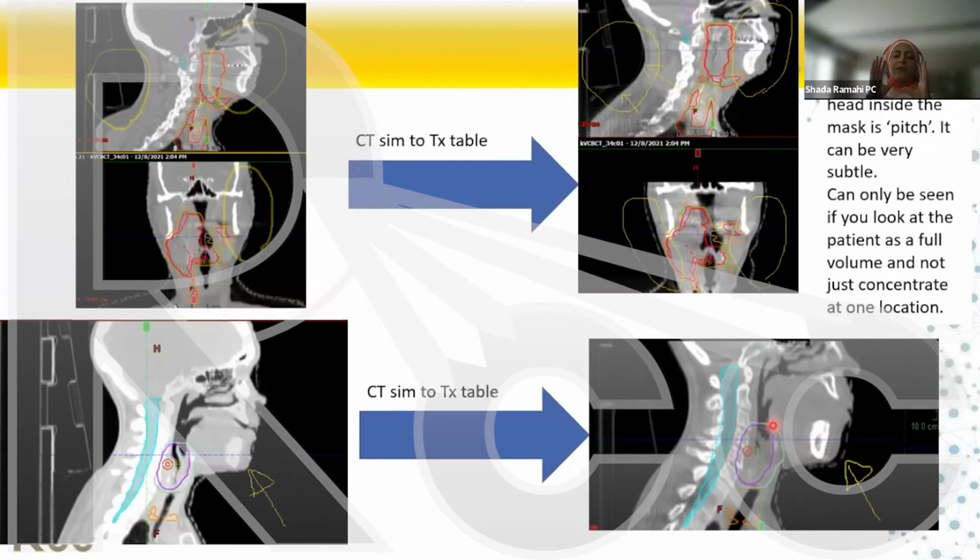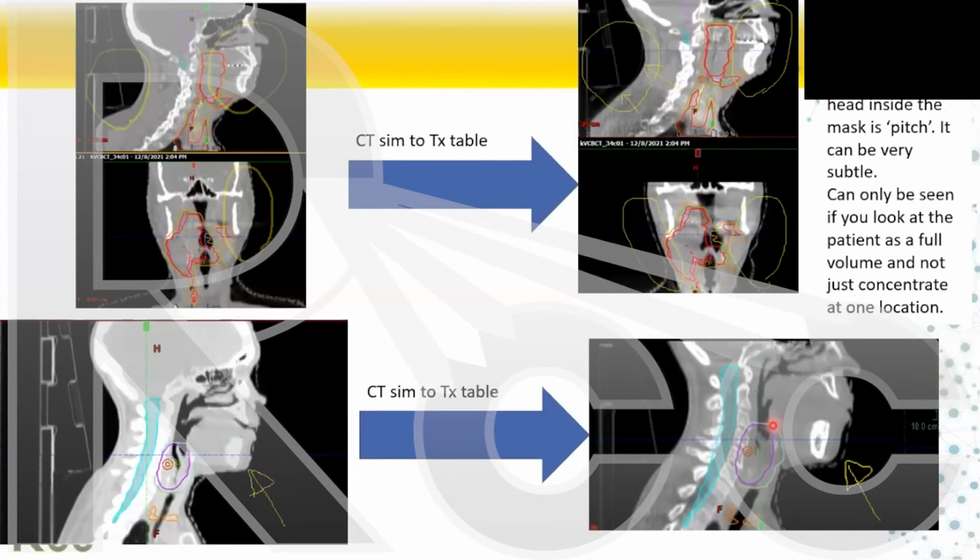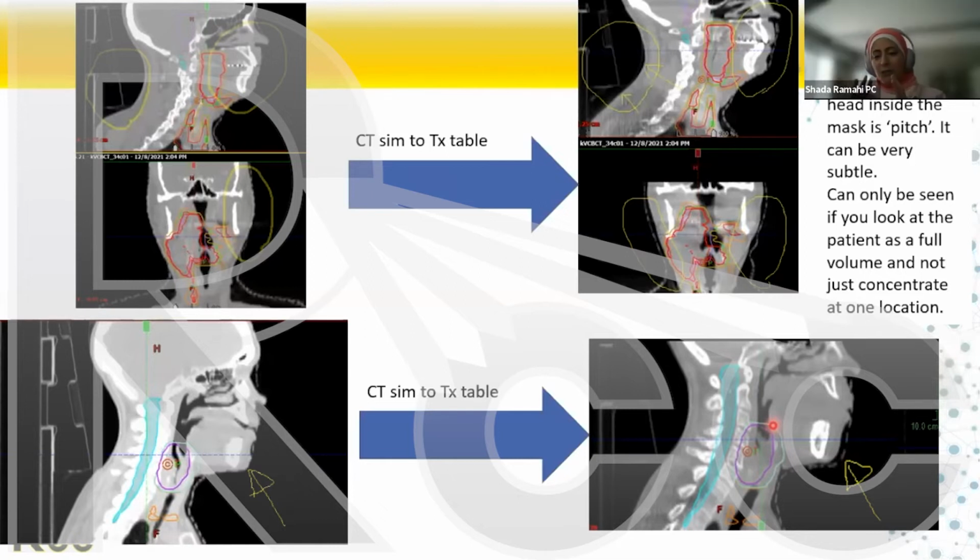The full immobilization. Is the patient nicely fitting inside the mask, and the arm position, because the arm position would affect the upper part of your lung, if you're pulling a little bit up or down, the upper part of the chest. If the patient is well aligned inside the immobilization device, then you can zoom into where the tumor is. So the process we have at our institution, when the patient is on the table, the SBRT or even SRS patient, the therapists do the immobilization, they do whatever KV they want to take for gross alignment, and then they do a CBCT, and then they do the alignment between the CBCT image and the CT SIM image, and then they call physics and physician.